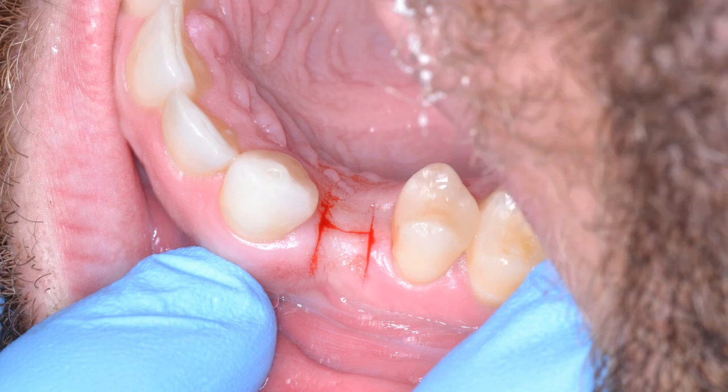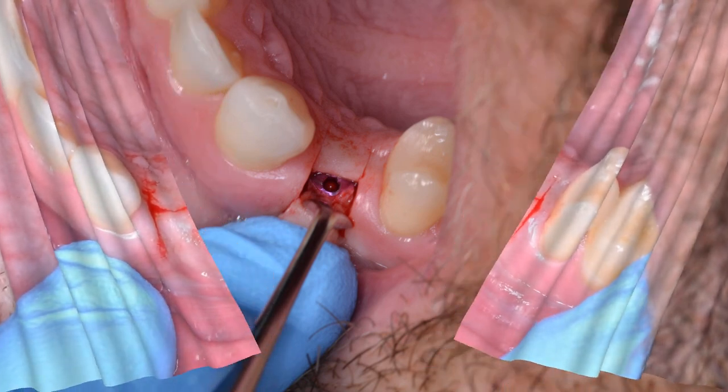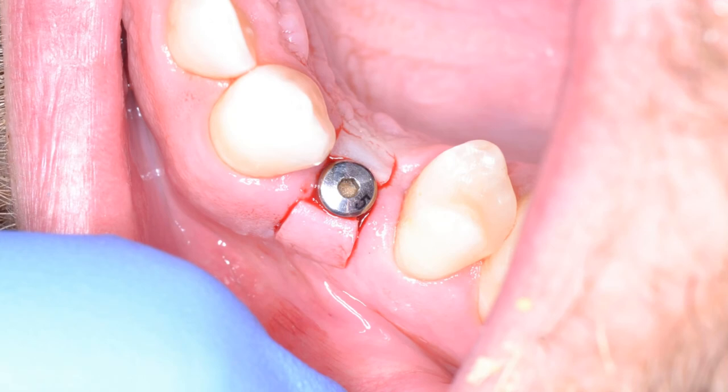You can see that tissue is moved buccally and lingually and really helps augment the soft tissue biotype around this particular patient's case. And we take an impression coping, put that in place, another open tray impression. You can see the open tray. Make sure that open tray fits. Take an open tray impression. Here it is taken. We put the fixture analog onto that impression and send it off with a UCLA abutment. In this particular case, the lab told me, mea culpa, I was a little bit too buccal in terms of placing this implant, so we weren't able to have a screw-retained crown, so we had to have a cemented crown.